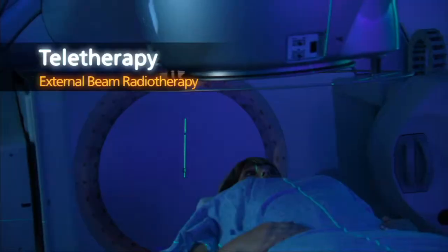There are two different types of radiation. One where the radiation source is actually placed within the patient next to the tumor or in a cavity where a tumor once was. That is referred to as brachytherapy. Alternatively, radiation can be delivered from the outside or from a linear accelerator or machine. That is referred to as teletherapy.